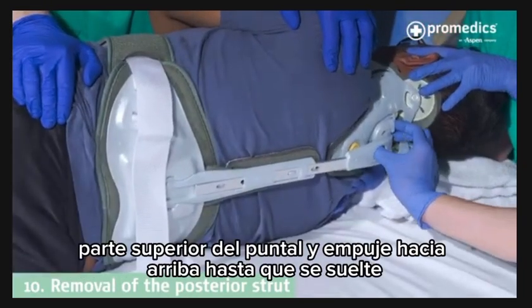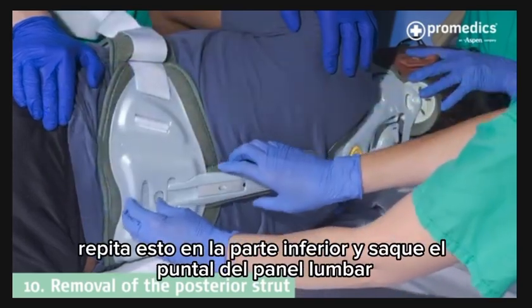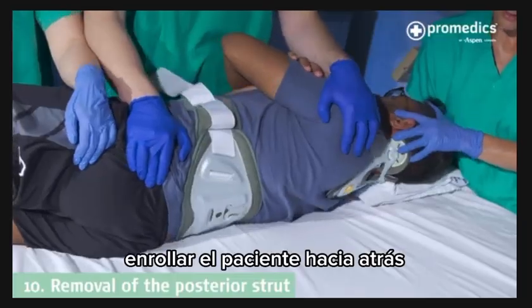Push in the button at the top of the strut and push up until it's released. Repeat this at the bottom and pull out the strut from the lumbar panel. Log roll the patient back.